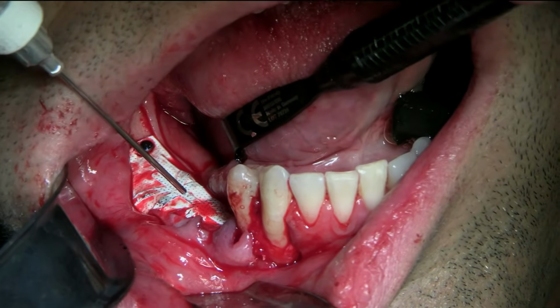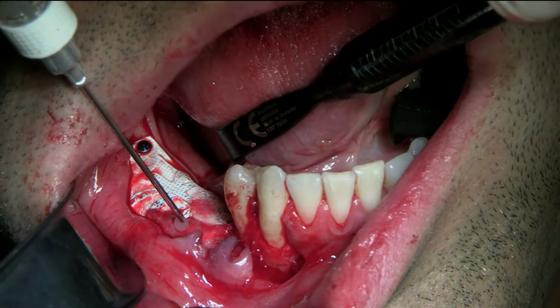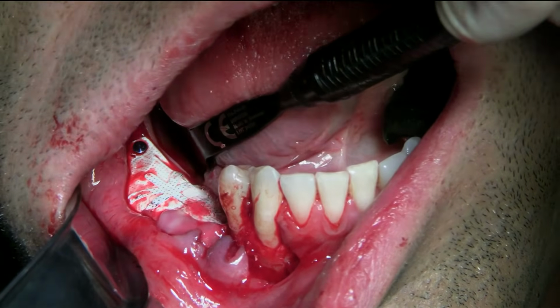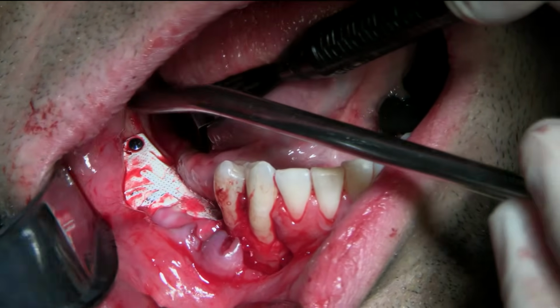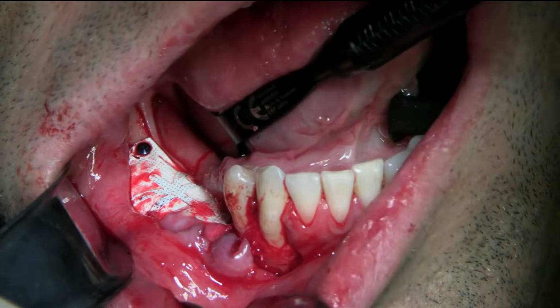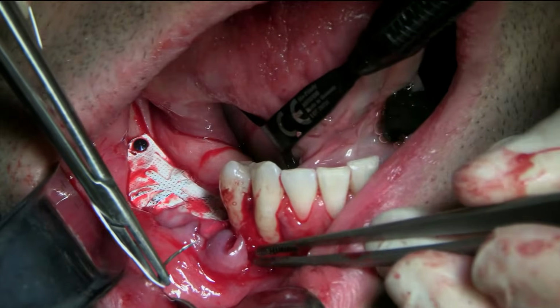Retract a little bit. See, it's a gel. I'm going to leave that just before I close. I'll do more. So now I start the suturing. And I'll start like right. I'm going to reposition the anterior just so I have a good visual where I want to go. So we'll put this one here first.